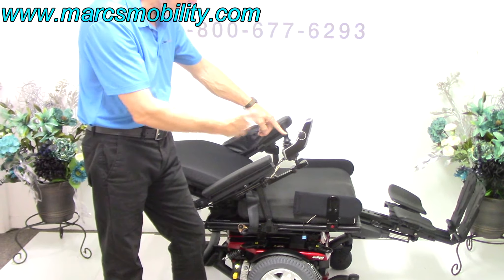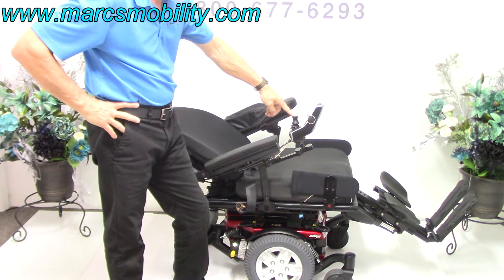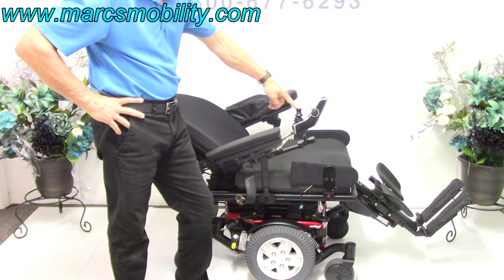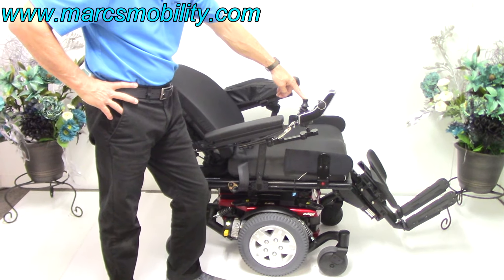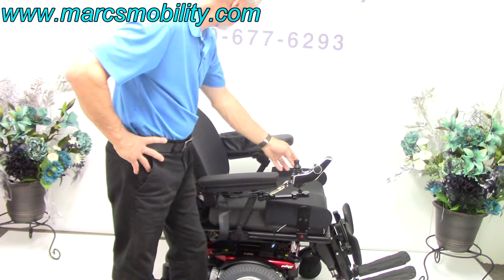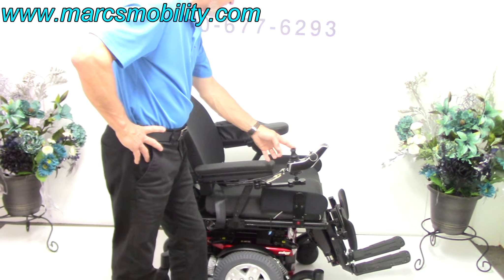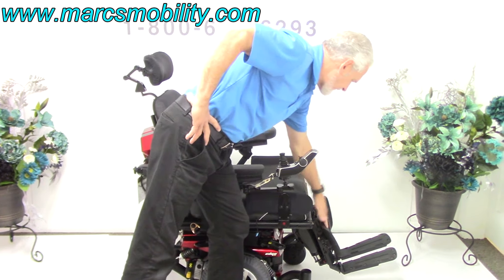I'm going to bring the legs and the back down at the same time — you can do two functions at once. Bringing everything back down now. I'll bring the back down separately once the legs get far enough, and they'll typically just fall down automatically.